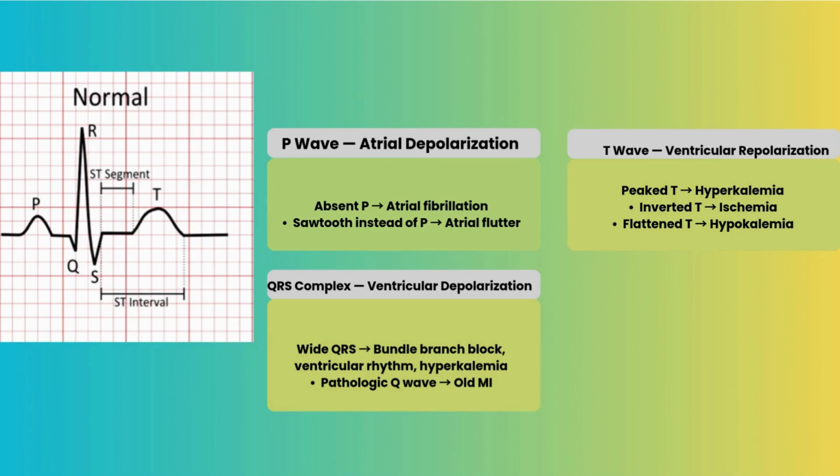And once P wave appears, the two atria will contract. Remember, electrical comes before the mechanical. We always expect to see this little hump before every QRS complex. That means if it's not obvious that it's there, then there's some sort of dysrhythmia in the atria. Could be atrial flutter if it looks like sawtooth, or AFib if it looks like a toddler trying to squiggle a line before the QRS complex happens.